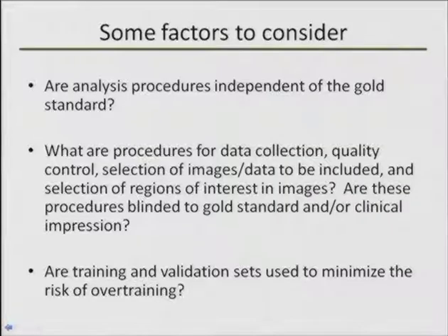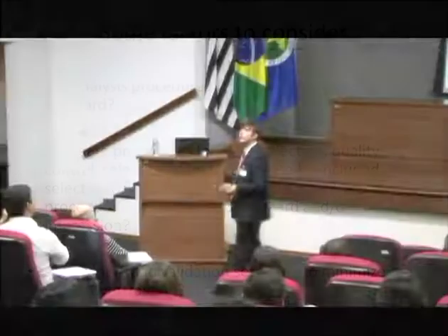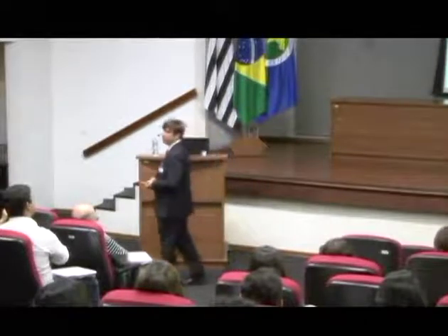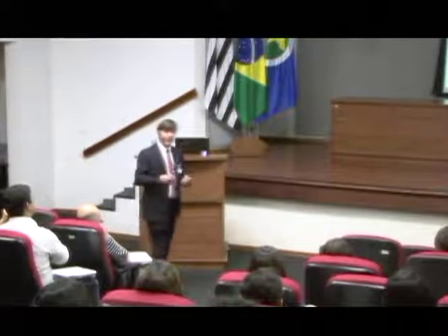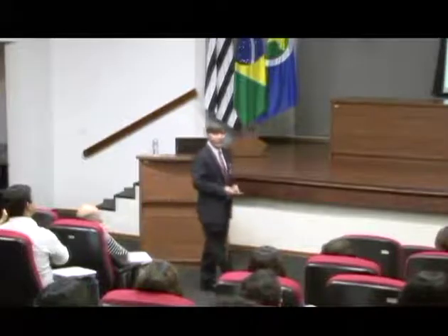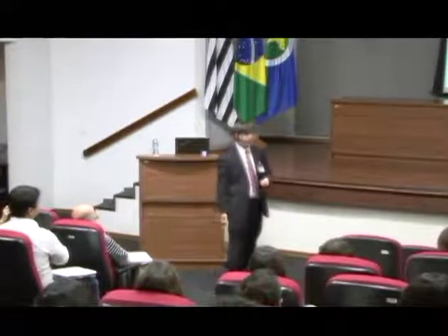Now, having just discussed sensitivity and specificity, I will say that sensitivity and specificity values alone are pretty meaningless unless you know something about how the clinical study was performed and how the data were evaluated. The literature is full of all kinds of pilot studies in 5 or 10 or 12 patients that show 100% sensitivity and specificity, and they simply do not hold up whenever those procedures are taken out into a more demanding and more realistic clinical environment. And there are several reasons for this.